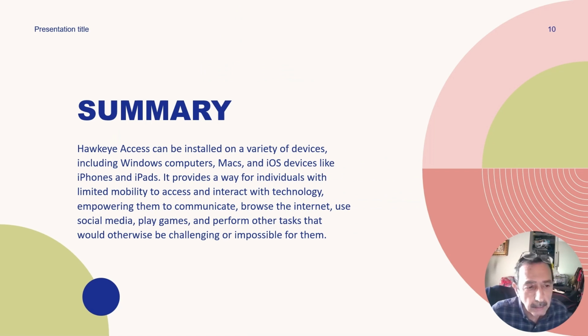As a summary, HawkEye Access can be installed on a variety of devices, including Windows computers, Macs, and iOS devices like iPhones and iPads.